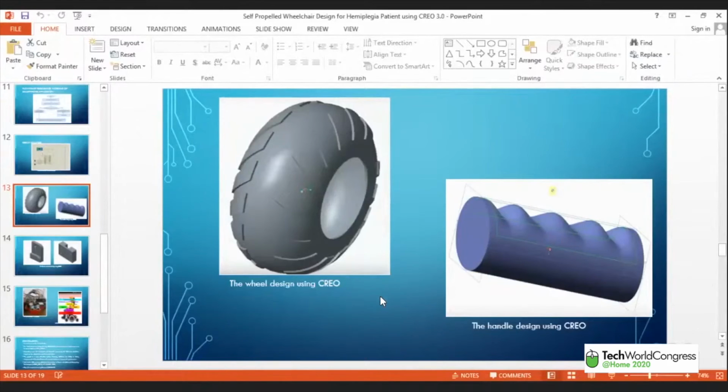Now, what happens is that if I make the wheels very light, the entire system may skid. The wheelchair may collide, right? So it was necessary to make sure that a balance is also available, because the patient may not be able to balance it on his own, right? So we opted for front wheels using this kind of design, and the back wheels, the rear wheels, we kept as they are. The regular wheels are sturdy enough, quite heavy.